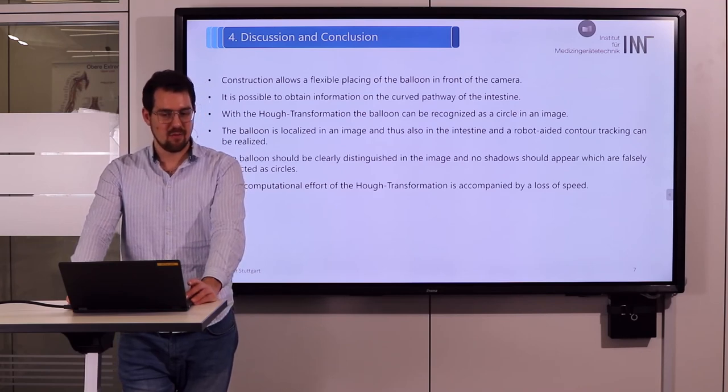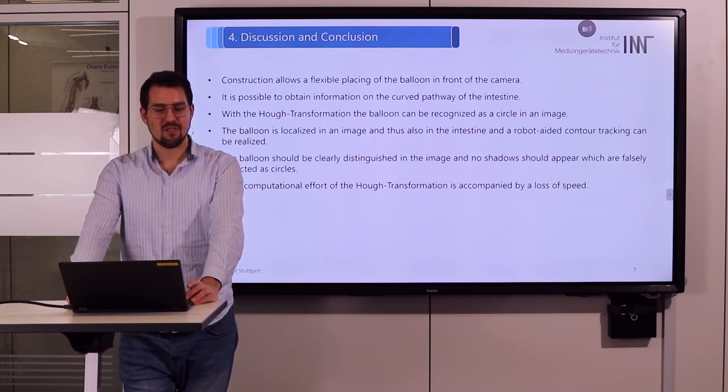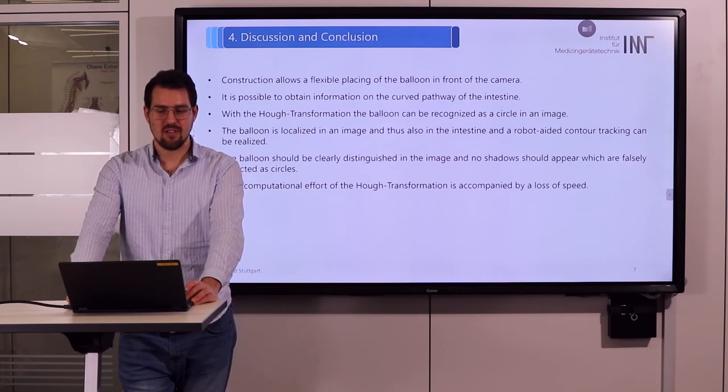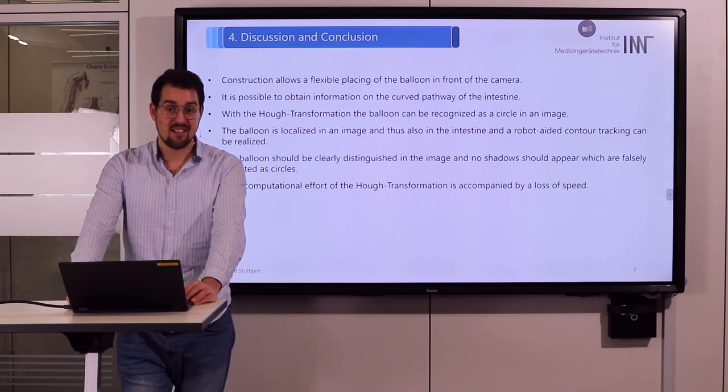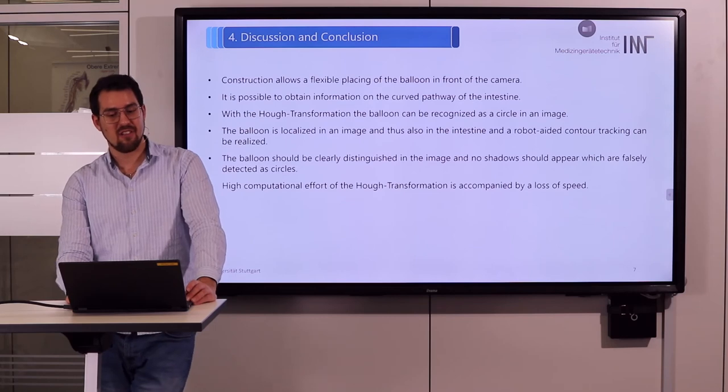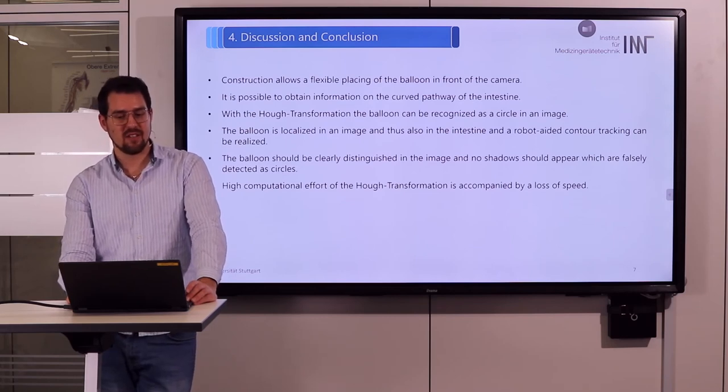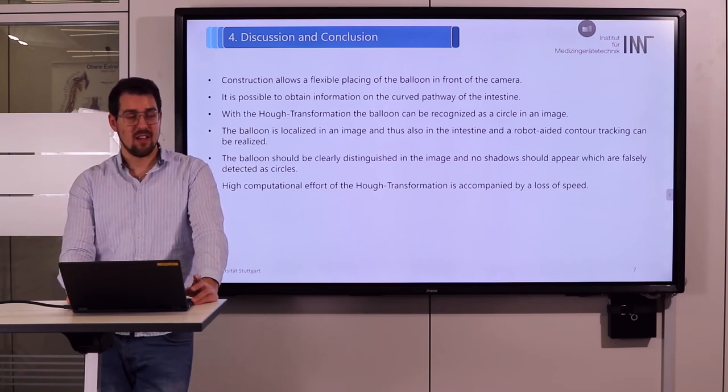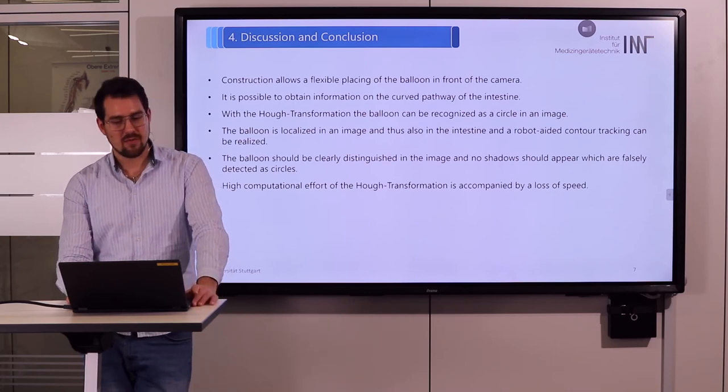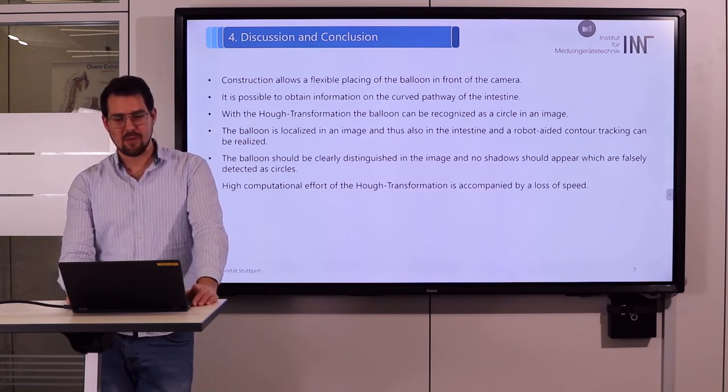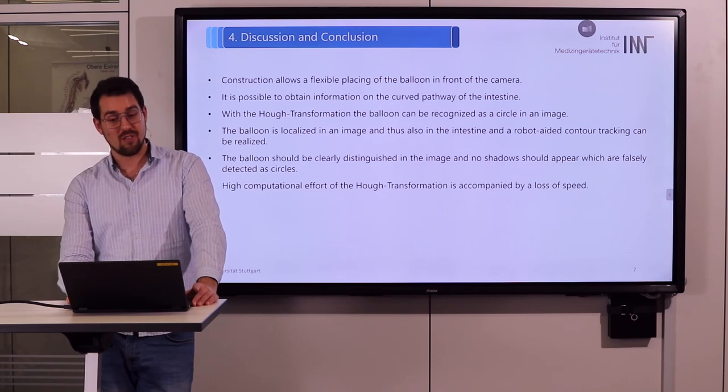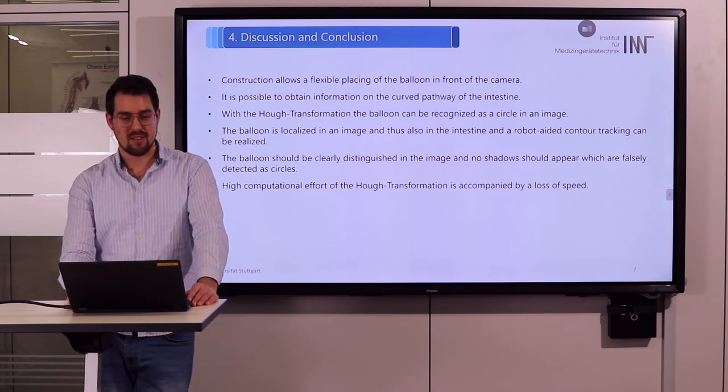However, the illumination of the intestine and balloon is insufficient at the moment, which is why it was not always detected due to low contrast. In addition, the high computational effort of the Hough transformation results in a loss of speed. You can see in the video we only have about 5 frames per second, when we want 20-25 frames per second.